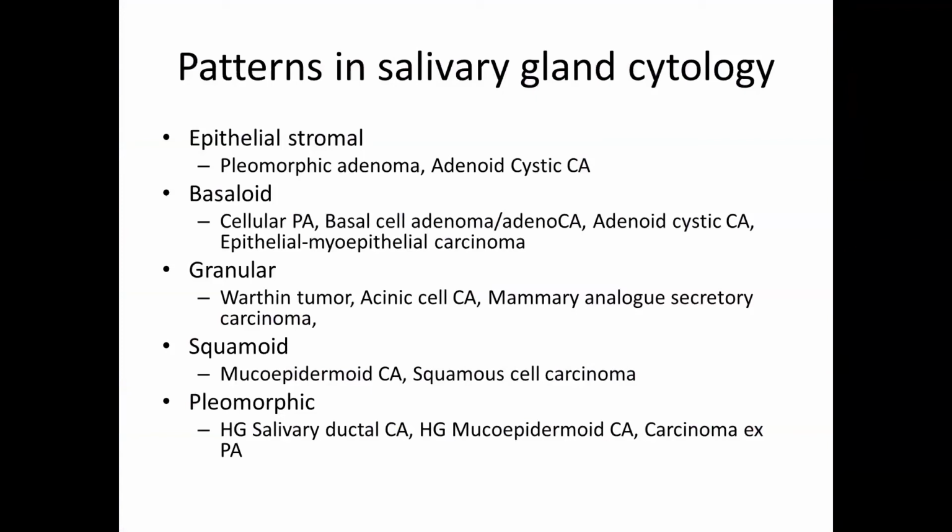So a good approach for these lesions, just because there are so many separate neoplasms that have been described, is to first, when you're dealing with an aspirate and you identify it as being a lesion, identify the big, broad overall morphologic pattern, and then look for specific features to hone down, if possible, on a definitive diagnosis, or a diagnosis that's as definitive as you're comfortable being given the specimen and the entity.